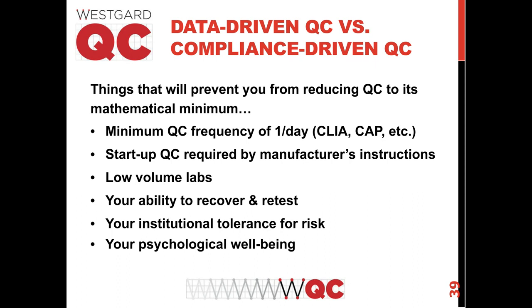Now, obviously, if you are comfortable with it, if you have the volume that would support being able to go once per 1,000 patient specimens, and you're still meeting all your manufacturer instructions and the CLIA regulations, then running QC at that frequency is probably going to be lower than where you were. And it will give you that opportunity again to save some money and be more efficient.